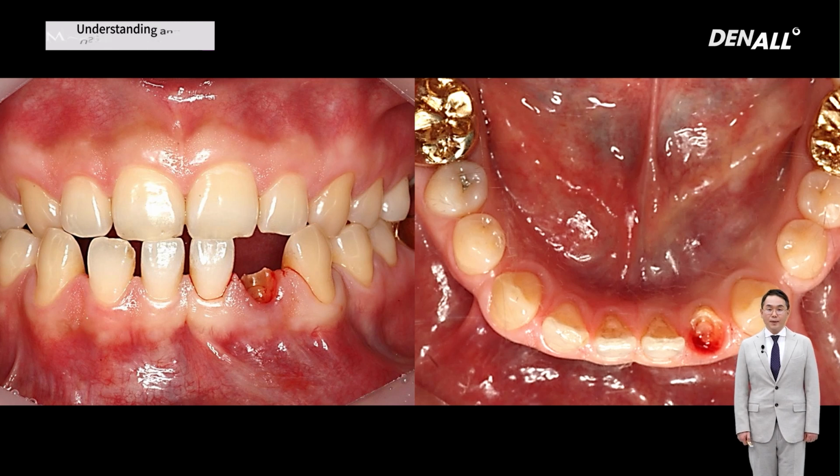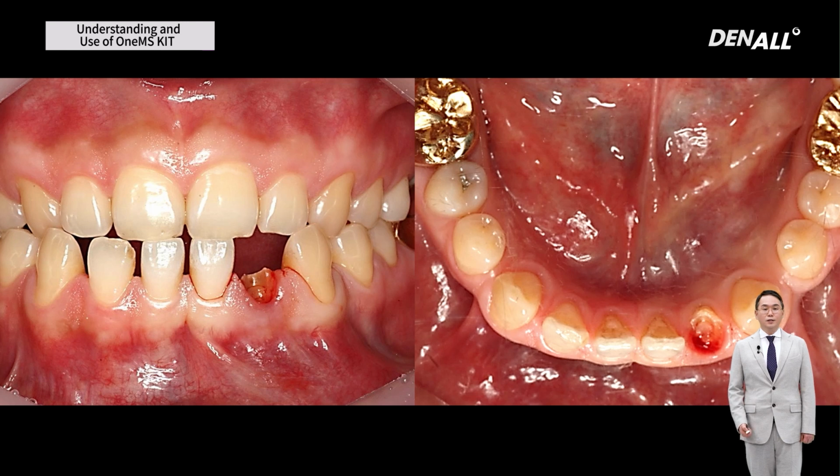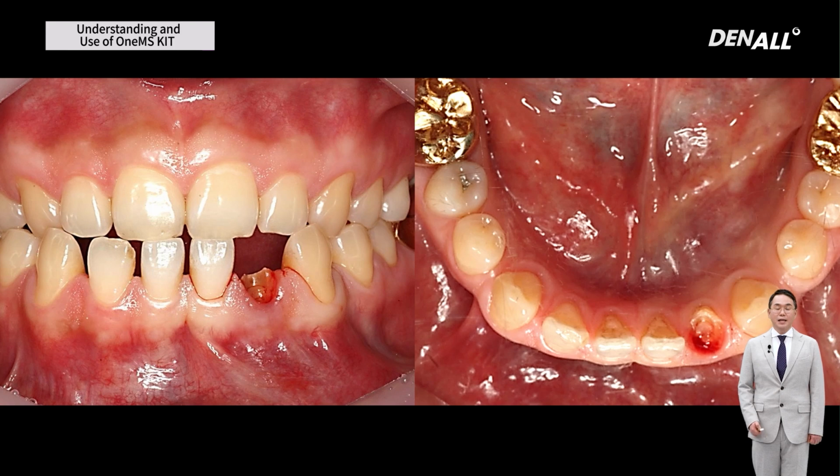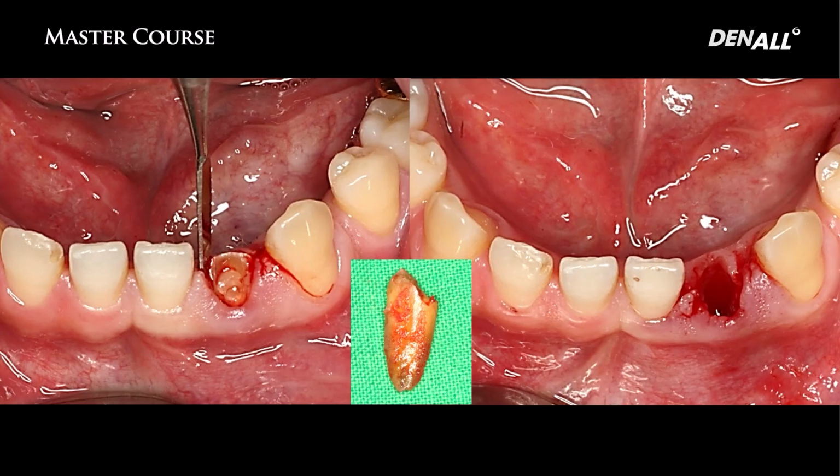MS implant. If you place a two-piece type implant, the diameter of the abutment on top of the implant would be bigger than the diameter of the cervical part of an adjacent tooth. Left and right side symmetry would not be achieved, so it would not be harmonious. But if you use a one-body implant, we can control the cervical diameter, so the prosthesis would be much more in harmony with the adjacent natural tooth. So the MS implant is chosen.